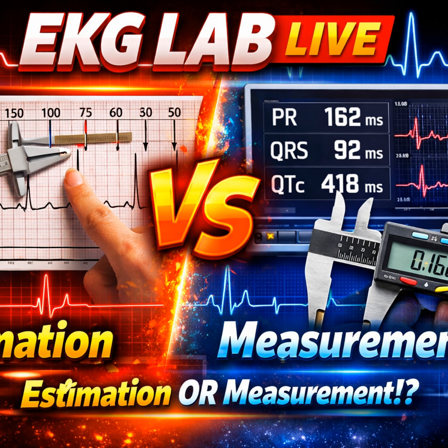I think we are circling the same truth here. Perhaps. Let's try to summarize our positions in light of this discussion. I maintain that while clinical context is a helpful adjunct, the EKG is fundamentally a tool of measurement. Whether you are calculating that pause in sick sinus syndrome to determine if it is 2.8 or 3.2 seconds, counting the large boxes times 0.20 and adding the small ones times 0.04, or measuring a PR interval to distinguish Mobitz 1 from Mobitz 2, the small box is the unit of truth. Without the math, you are operating on assumptions, and assumptions kill.